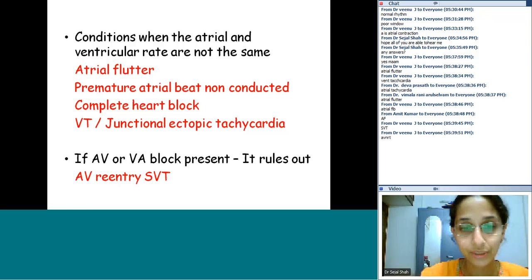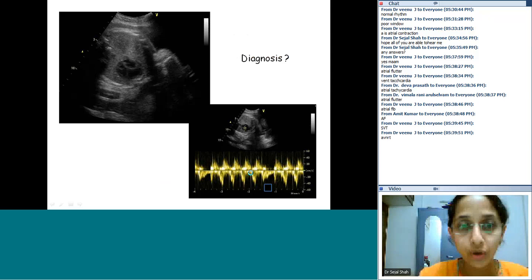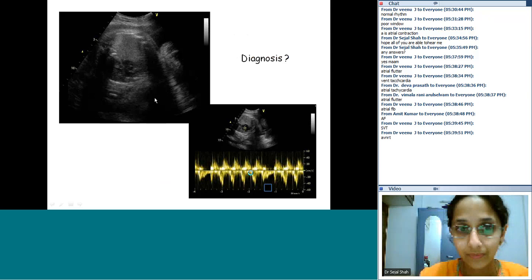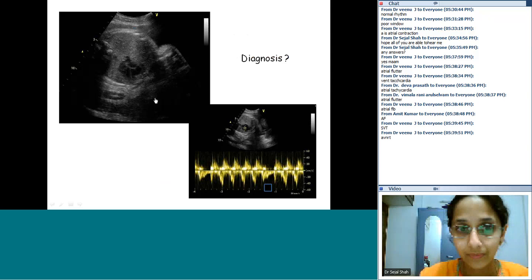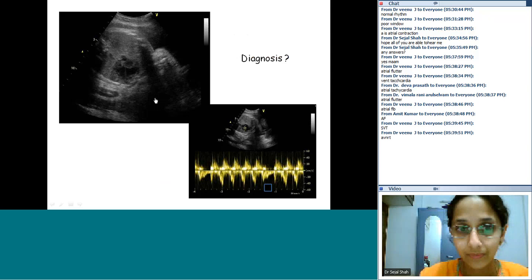So with this understanding, now we will go with the first figure. You can all closely observe the running image. I will play it once again, and you can keenly observe grossly the heart is structurally normal, but if you would pay attention to it, you would realize that there is something wrong with the way it's beating.